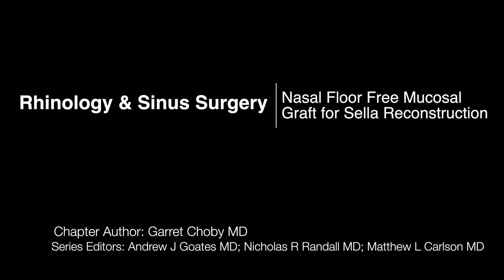Hello, this is Garrett Choby, and today we will be showing a video of a nasal floor free mucosal graft for sellar reconstruction. This is following the resection of a non-functional pituitary macroadenoma with a mild to moderate CSF leak in surgery through the sellar diaphragm.